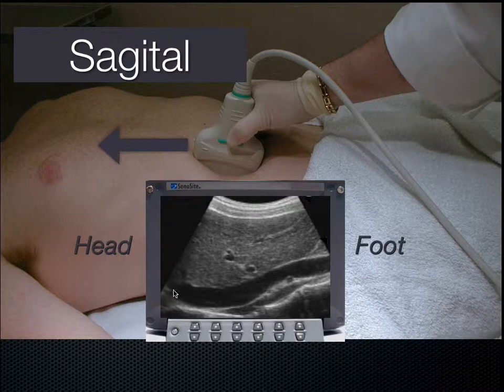And I can see this is blood draining towards the right atrium of the heart, up this way, though off the screen, and the blood was coming from the lower portions of the body down here. So the blood is actually traveling in this direction towards the head. Okay, sagittal plane. It means longitudinal when approached from the anterior location.